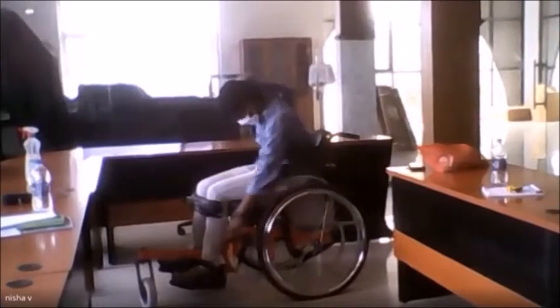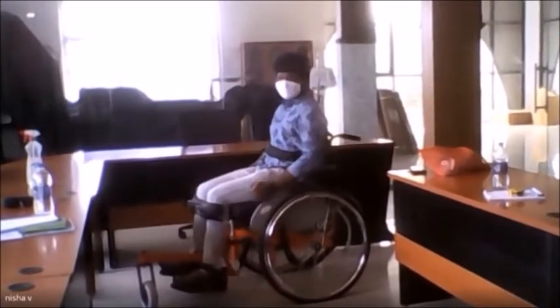So as you can see, there is a knee lock, which is very important here. On standing, the person maintains an angle of 80 degrees with the ground. Can you stand again one more time? So there's a gas spring that needs to be calibrated. We'll discuss more about that at a later stage, according to the weight of the individual, and that helps in assist standing. Thank you very much.